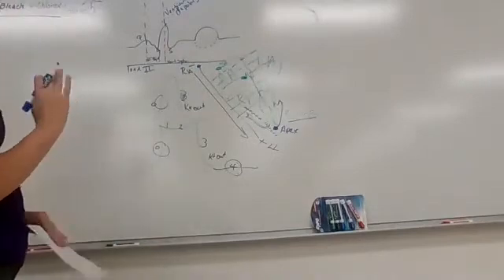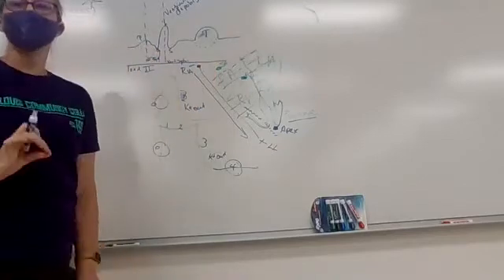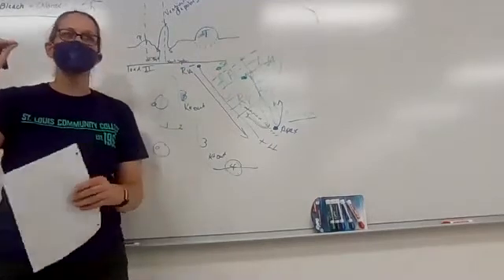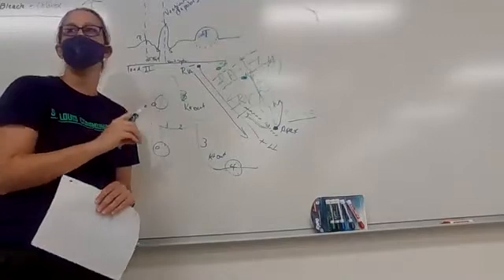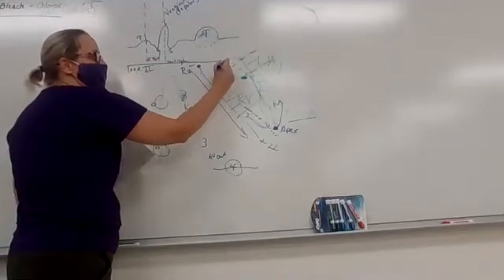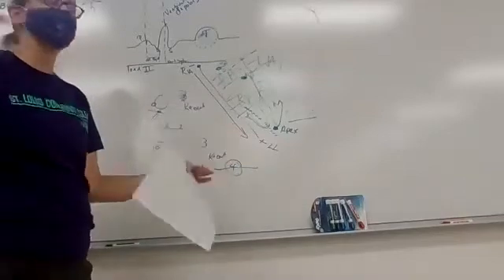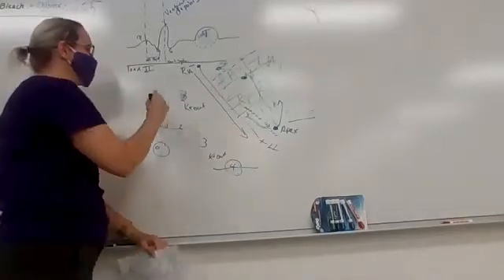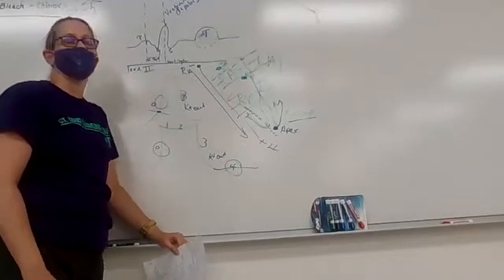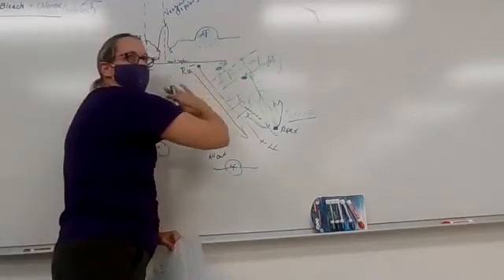All right, so the key things that you have to know, again, first wave you should see on an EKG is a P wave. The P wave represents the atria are depolarizing. It is the SA node initiating potentially a contraction because the SA node hit threshold and started rapid influx of calcium, phase 0, action potential ion movement. Okay?